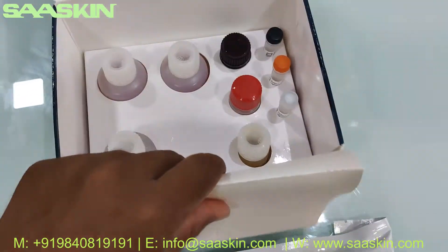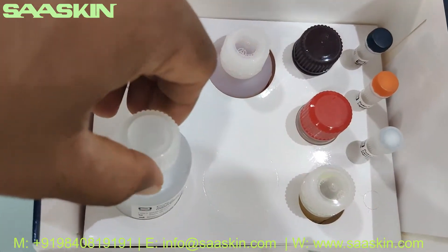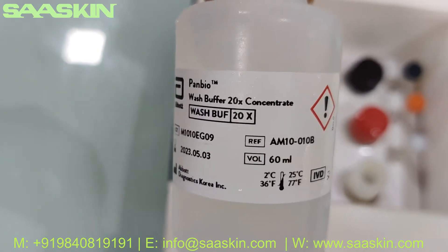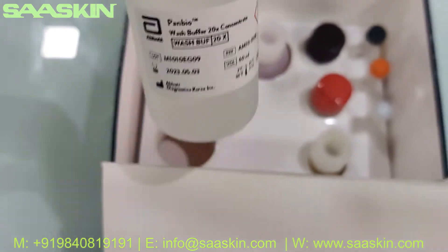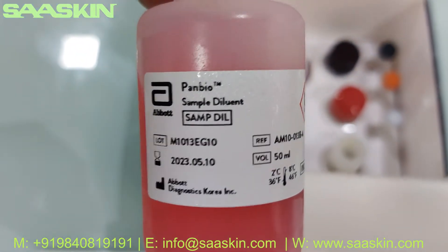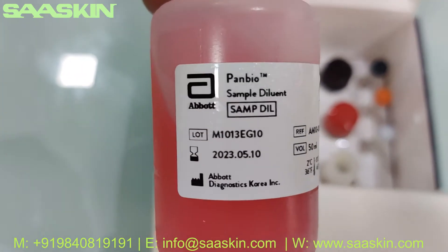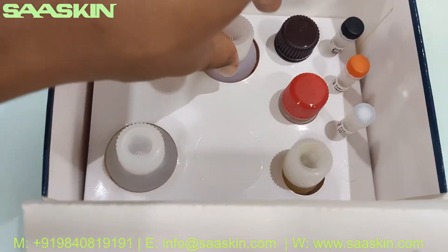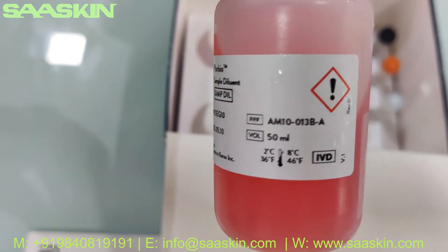We've got all the reagents and liquids inside. Let me show you one by one. First, this is the wash buffer liquid. Next, you've got the sample diluent buffer solution — this is a 50 ml bottle. There's one more bottle of the same, again the sample diluent buffer solution, another 50 ml bottle.